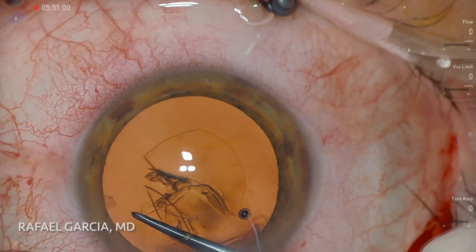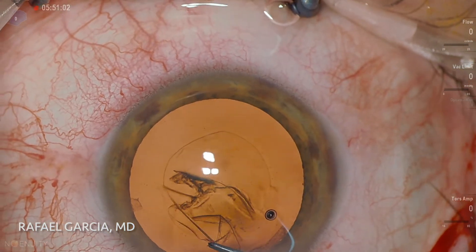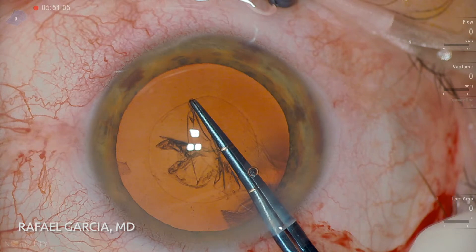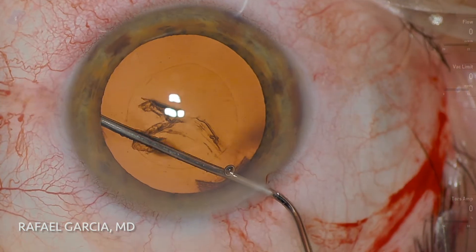This way, all the structures of the anterior chamber can be seen in detail. A nice and round 5mm capsular rhexis is achieved. Note that these Utrata forceps have some marks on their jaws, which are really helpful to guide us in the creation of an adequately sized rhexis.